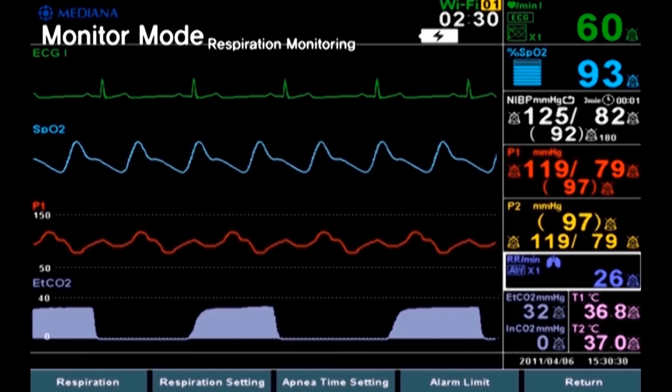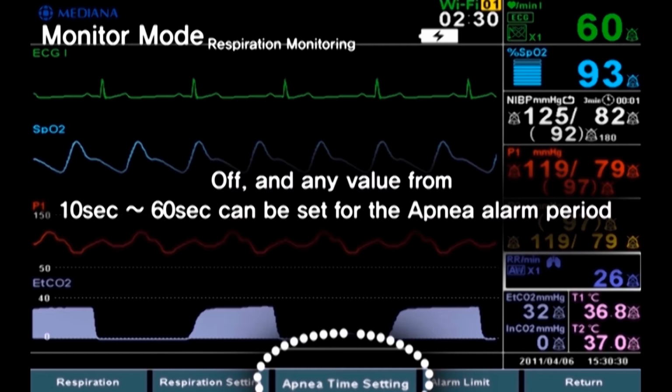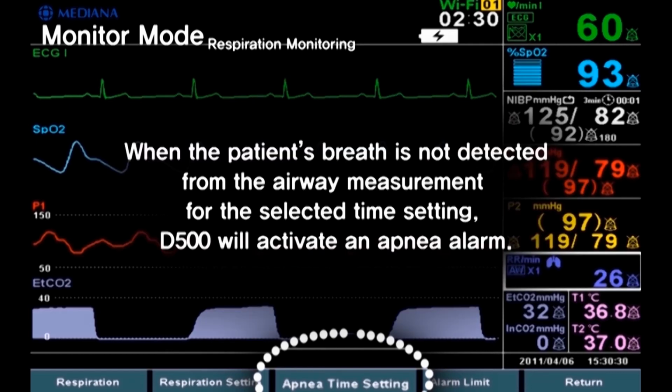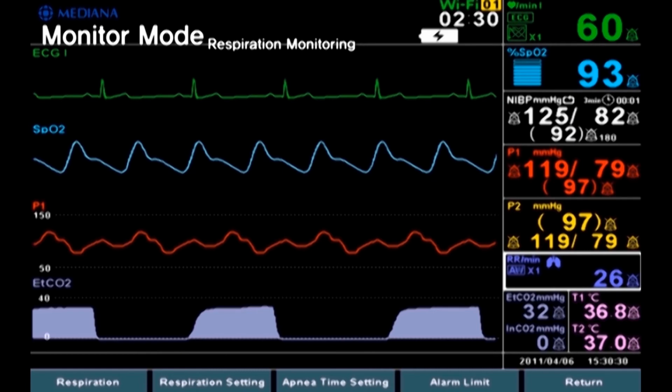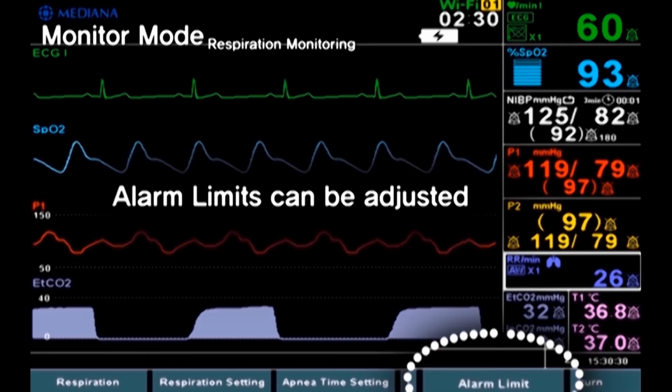Number 3, apnea alarm period setting. Off, and any value from 10 seconds to 60 seconds can be set for the apnea alarm period. When the patient's breath is not detected from the airway measurement for the selected time setting, D500 will activate an apnea alarm. Number 4, alarm limit. The alarm limits can be adjusted.